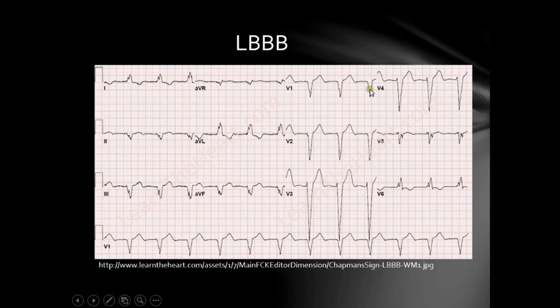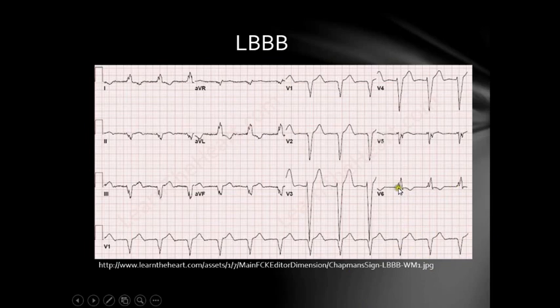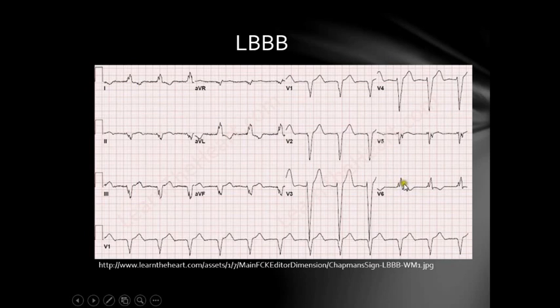Here on this slide, we have a characteristic ECG of a left bundle branch block. Looking at V6 in the lateral leads, we can see the M-pattern — the R, S, R-prime pattern — with the R-prime being taller than the R-wave, which is characteristic for left bundle branch block. We can also see absent Q-waves in the lateral leads, and ST-segment depression and T-wave inversion (though not necessarily always present). T-wave inversions can also be seen in leads 1 and AVL. The QRS complex does not necessarily need to be M-shaped — it could be notched or monophasic — but it's important to have the two R-waves. A wide QRS complex of more than three small squares indicates a complete left bundle branch block, not an incomplete one.